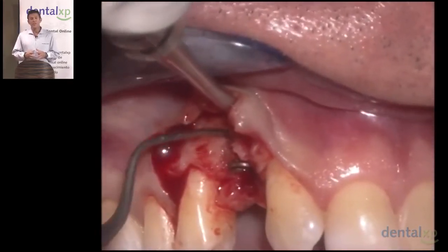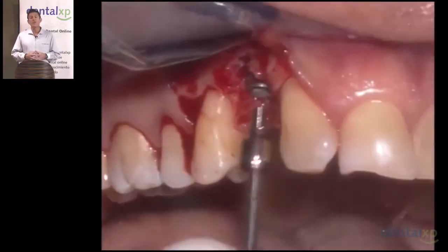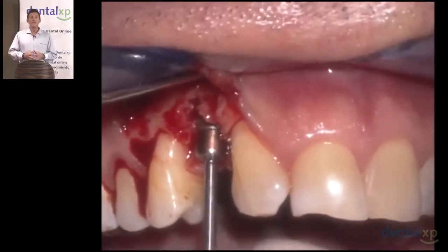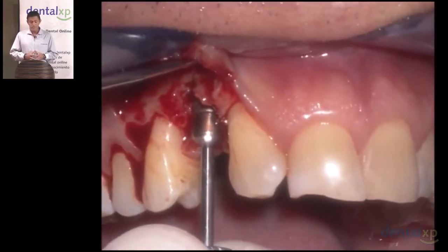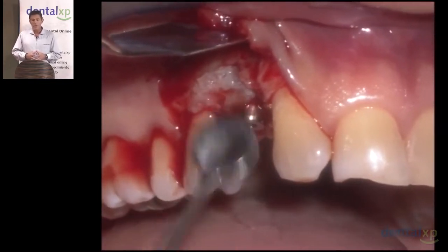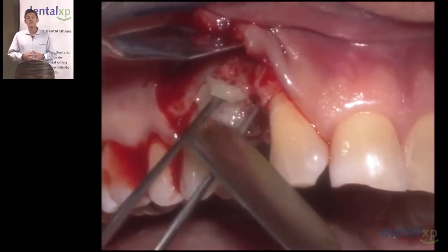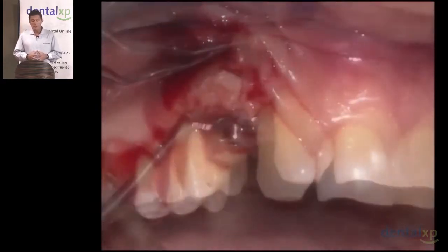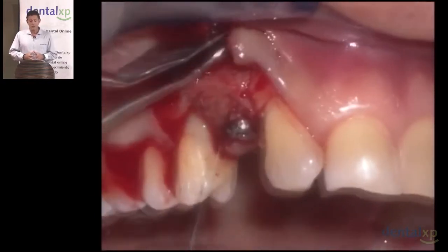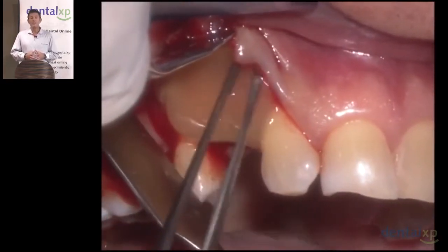We're going to remove any of the softer granulation tissue from the previous extraction, and we're going to graft utilizing a mixture of blood-borne bioactive materials, in this case PRGF and mineralized irradiated bone. Here is the mixture utilizing the PRGF material and the irradiated bone. This is a 50-50 mixture of cancellous and cortical bone particles, small particle sizes 250 to 850 microns, and this happens to be Mineross from BioHorizons. We're going to place this utilizing the sticky nature of the blood-borne bioactive materials. PRGF is plasma rich in growth factors and a BTI product.